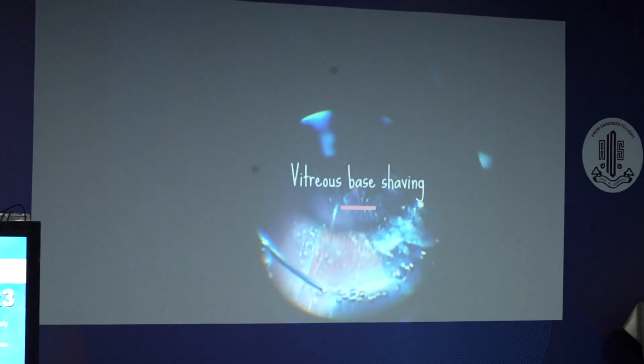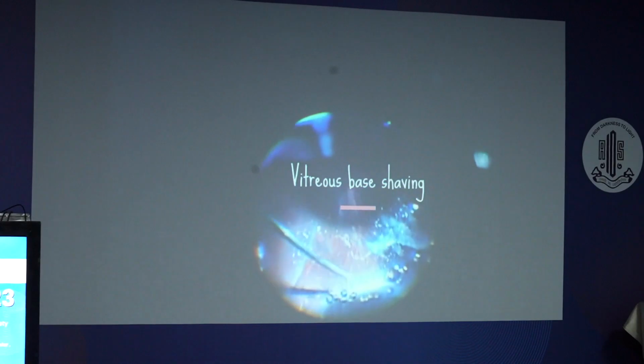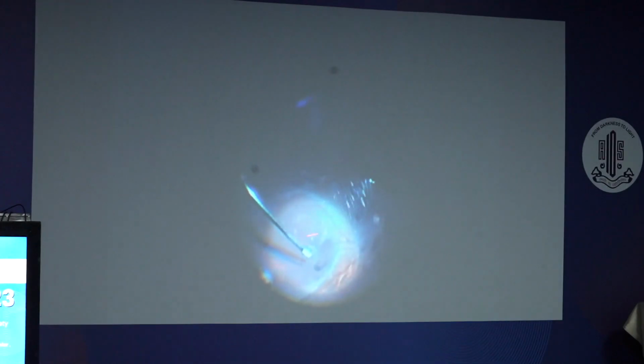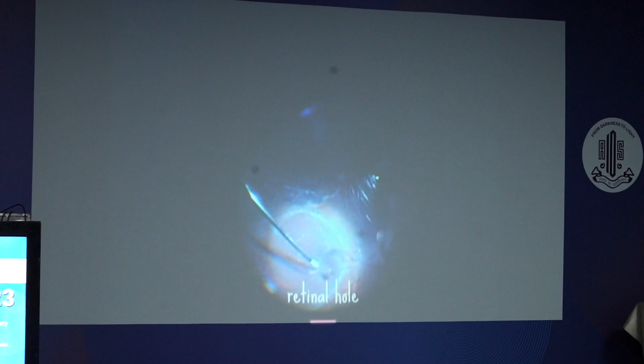So in a patient whose majority of the retina is settled, would you do a retinotomy in the detached retina only to use a PFCL? Still. So after PVD, we could suspect a break here. Is it PVD induced or is it a previous one?